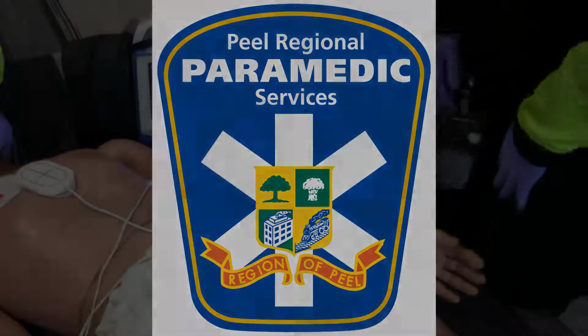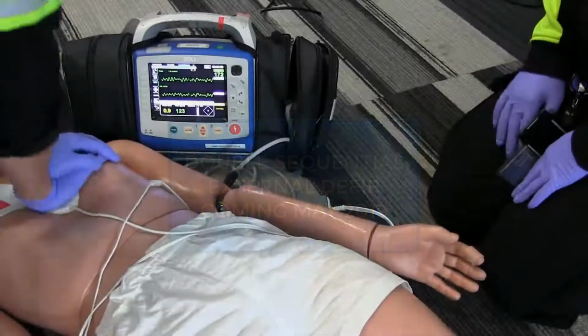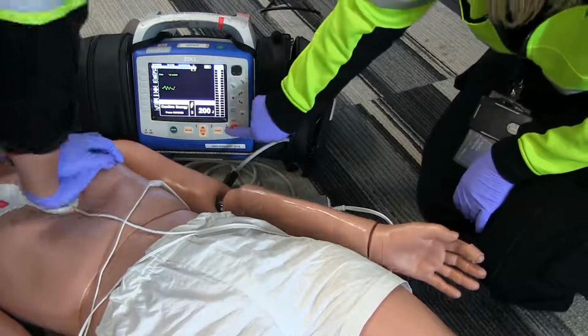This video will show how to perform a double sequential defibrillation using two Zoll X series monitors. Stop CPR. Let's analyze the rhythm. Patient is still in VF. Continue CPR. We're charging to 200.